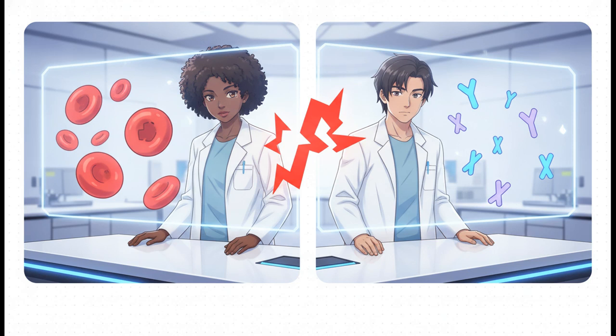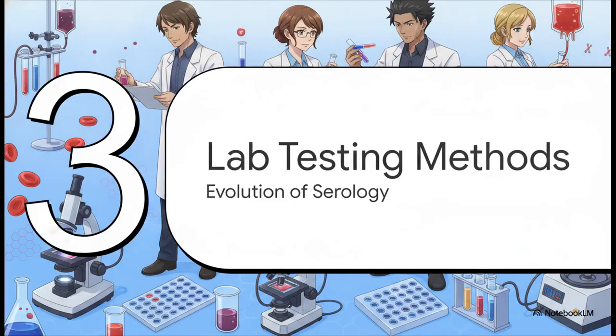If the forward test says type A, but the reverse test is missing the expected anti-B antibodies, well, we've hit an ABO discrepancy. And in a medical lab, a discrepancy means a full stop. Nothing moves, no blood is issued, until that puzzle is completely solved. So with that theory laid out, let's talk about the physical testing methods and how they've evolved over time.